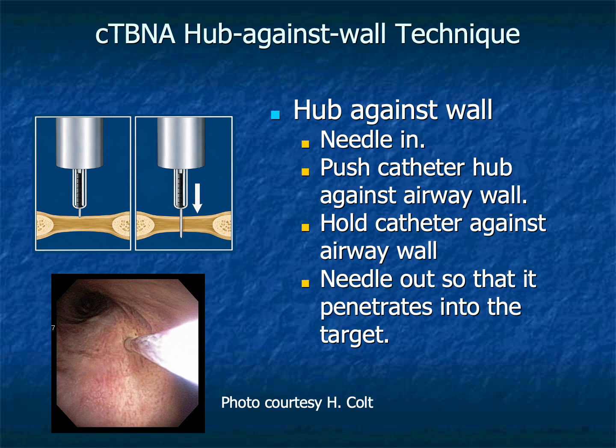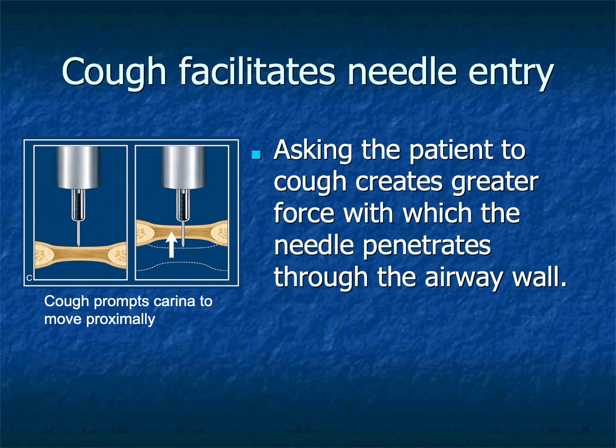Each technique has advantages, and experienced bronchoscopists often develop a personal preference depending upon airway anatomy, target location, and patient factors. An interesting technical observation is that patient coughing can sometimes facilitate needle penetration. During a cough, movement of the carina and surrounding airways generates additional force that may help the needle pass through the wall with less effort from the operator. Rather than viewing every cough as an interruption, experienced bronchoscopists occasionally use this natural physiological movement to their advantage.